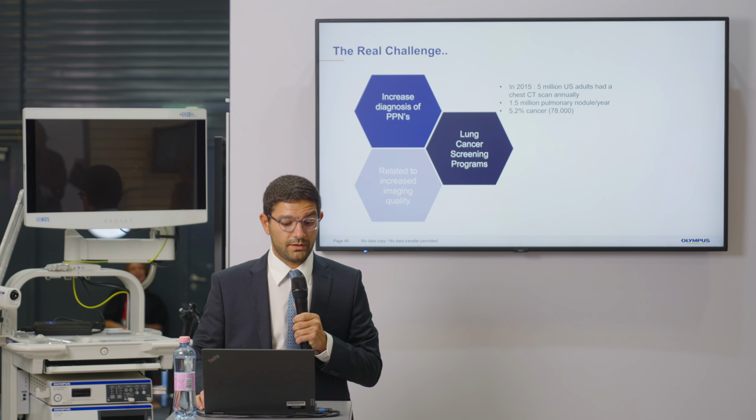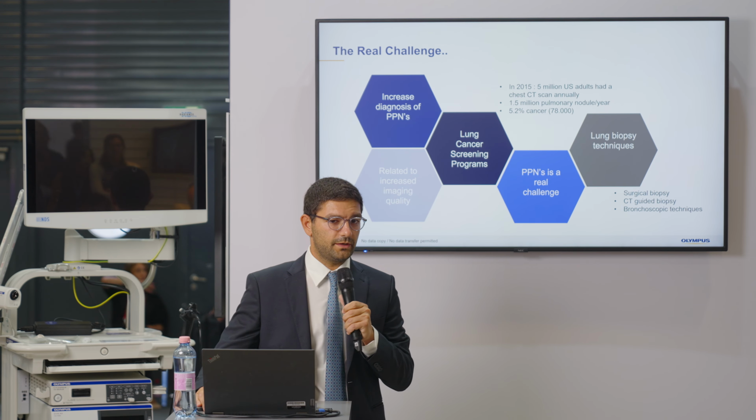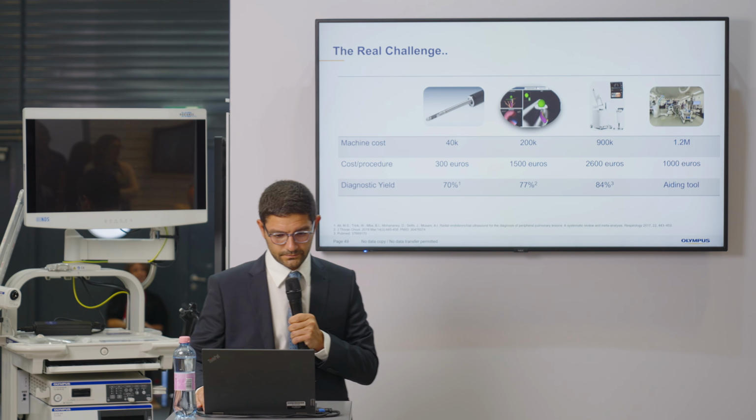The problem is that these nodules are still a challenge for interventional pulmonologists, because the 3 techniques with which we can obtain a lung biopsy are surgical, CT-guided biopsies, and bronchoscopic or minimally invasive endoscopic procedures.